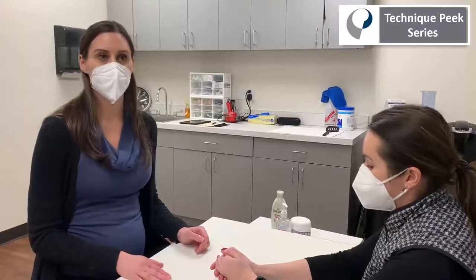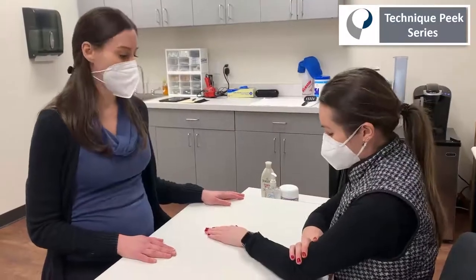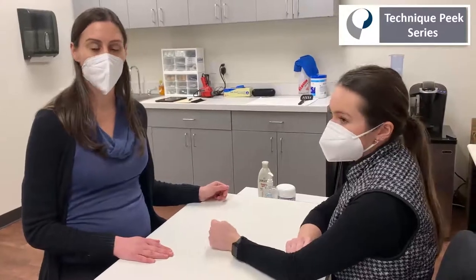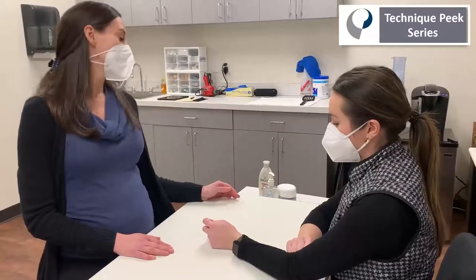Today I'm going to talk about how to make it to mobilize a PIP joint. This can be used to mobilize a stiff PIP joint, and it could also be used to enhance tendon excursion if there are any scar adhesions that are limiting active range of motion of the PIP joint.